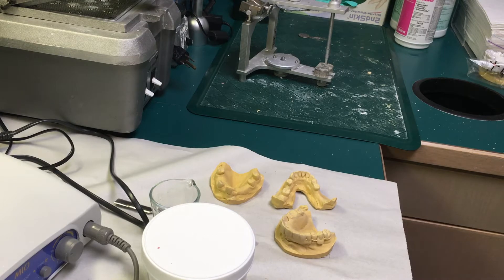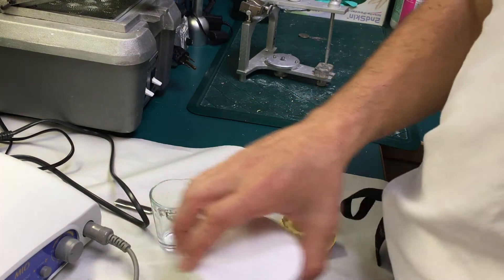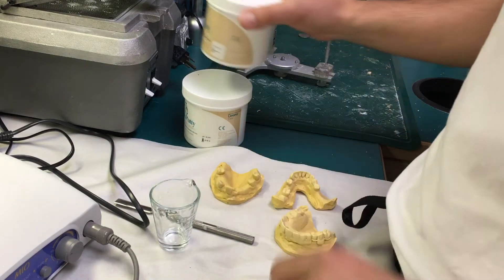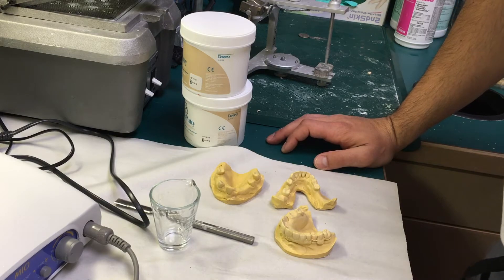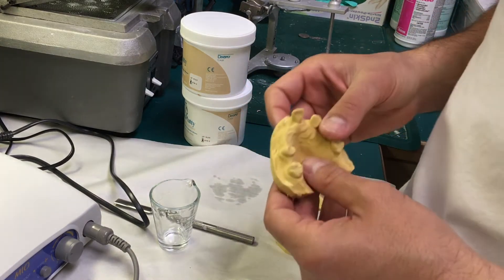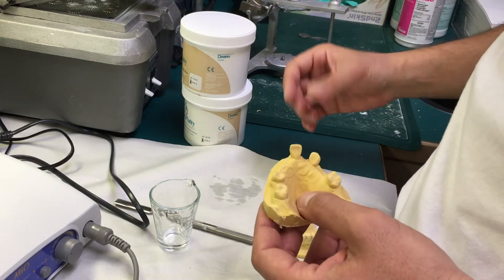This is an educational video about creating a very basic radiographic guide for a partially dentulous case, where we are going to be placing selected implants to support the removable partial denture.